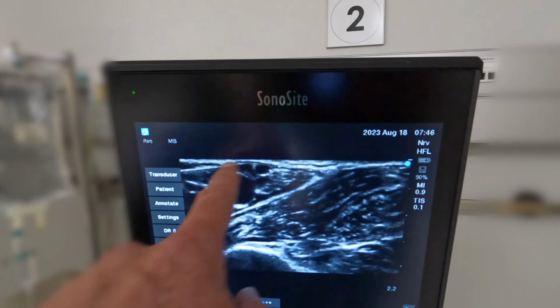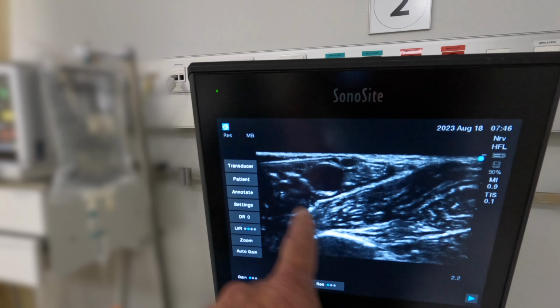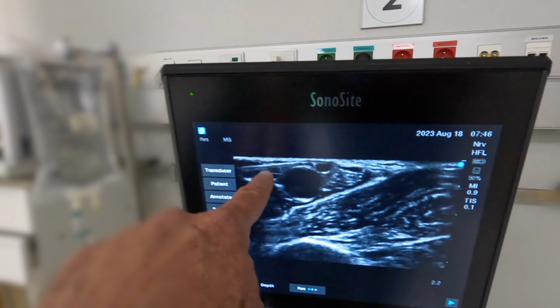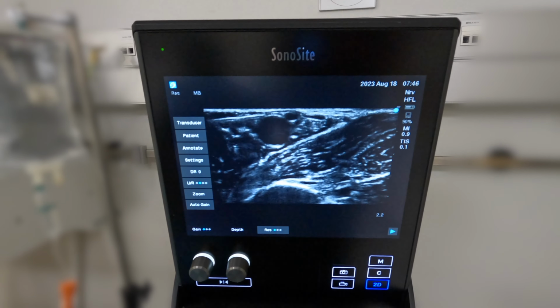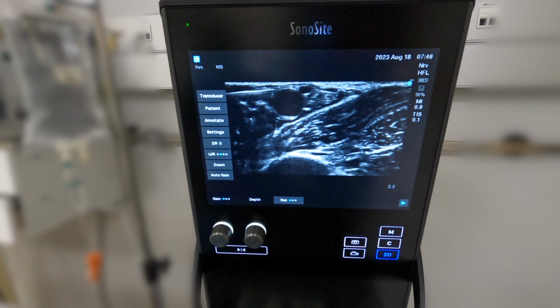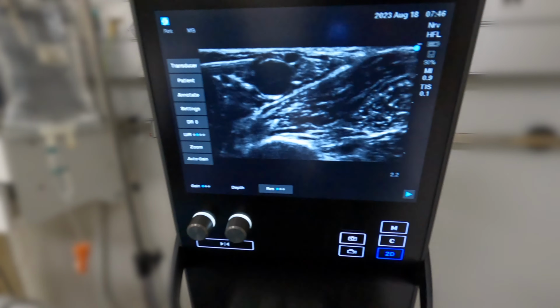So now we can see how that local anesthetic affects the ulnar nerve, spreads into the sheath, and also affects the median nerve. So we're going to go back, give 1 mL of local anesthetic just above the median nerve. Go back, go back, go back. There. Aspirate, inject 1 mL. That's done. Good. So we're finished with the axillary.